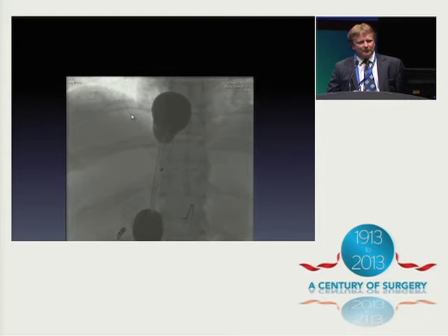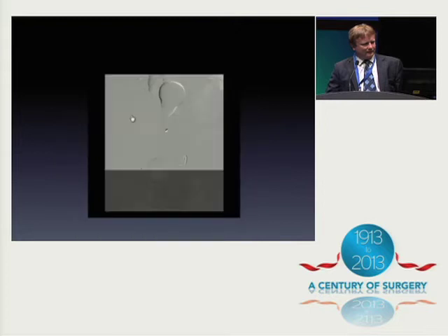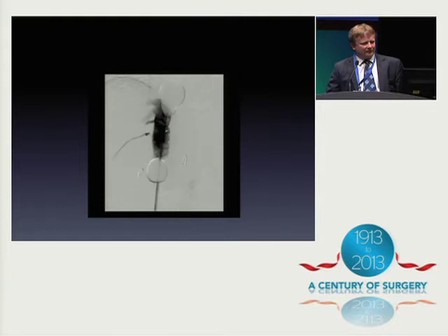Okay, so you blow up the lower balloon inside the IVC, and then you do a test run retrogradely filling the IVC through what will be the drainage port and looking for leaks around and about. At the upper end there you can see the middle and right hepatic veins, but also a load of short hepatic veins, and also lower down some retrograde filling of the lumbars.